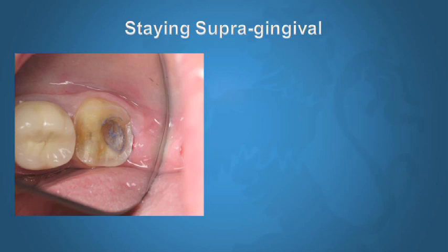Another important point, as you see right here in this particular example, this is really an onlay prep, but the reason why I'm showing this to you is because you can see again the enamel preservation approach. I have a full thickness of distal enamel, but I still have caries on the dentin. Now, if I was going to remove the unsupported enamel, my preparation margin would clearly go 2 millimeters below the gum. And now we're getting into a complicated situation.